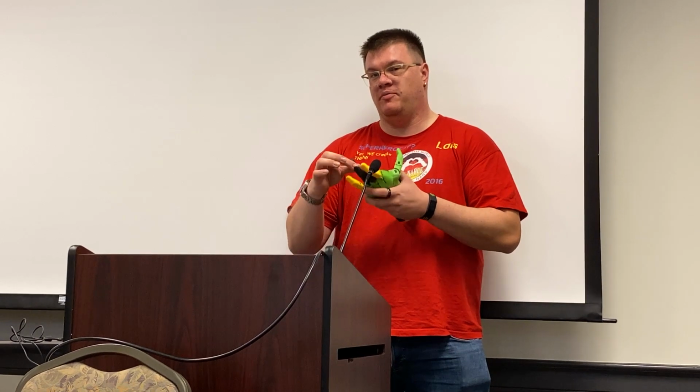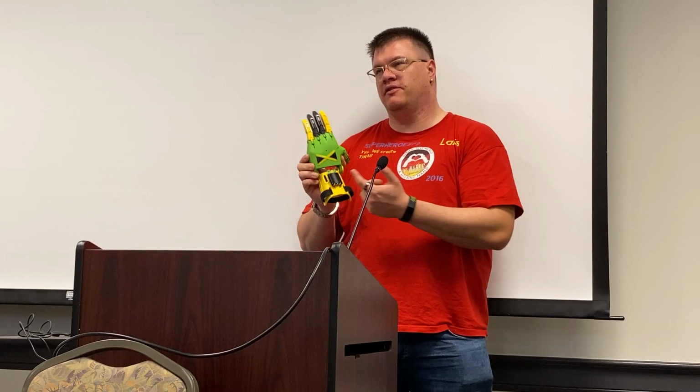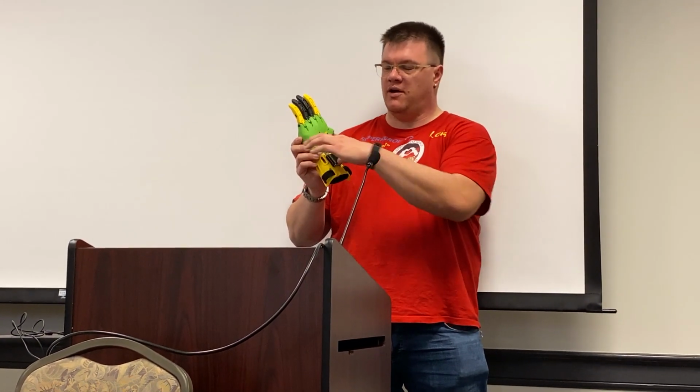For my bachelor thesis, I analyzed the Phoenix hand. I took it from scratch because my professor said this is a good topic, but just figure out something that you want to test. So I figured out, okay, I have to test the nylon strings, I have to test the knots. The next logical step is the knots are connected with the fingers, so I have to test the PLA as well. And for me, a critical part was this part here, because there you have PLA connected with screws. So I built this up.